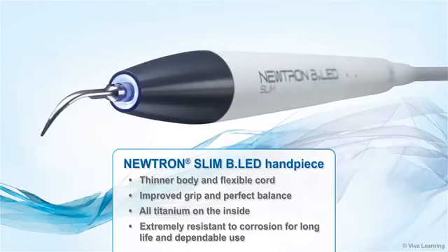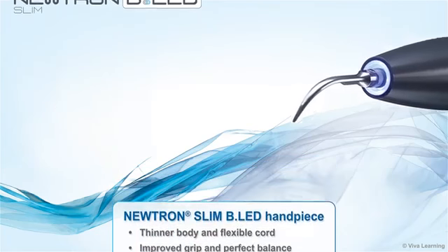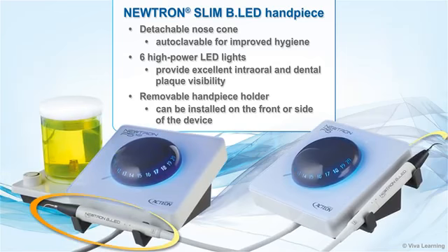With its thinner body and flexible cord, the Neutron Slim BLED handpiece offers an improved grip and perfect balance. Constructed with all titanium on the inside, the handpiece is extremely resistant to corrosion for long life and dependable use. The detachable nose cone is autoclavable for improved hygiene. The six high power LED lights provide excellent intraoral and dental plaque visibility, and the removable handpiece holder can be installed on the front or side of the device, depending on your preference.